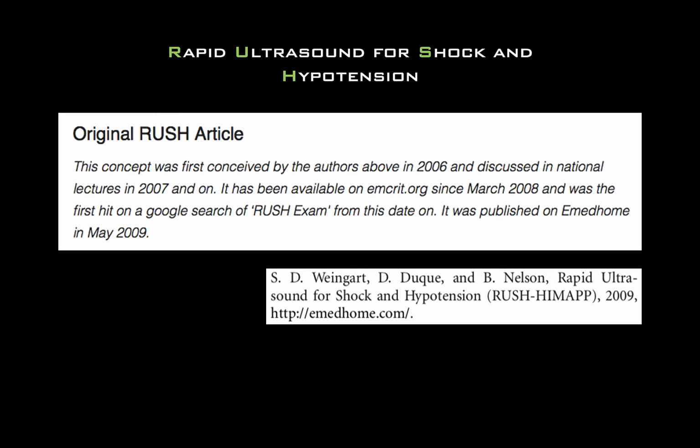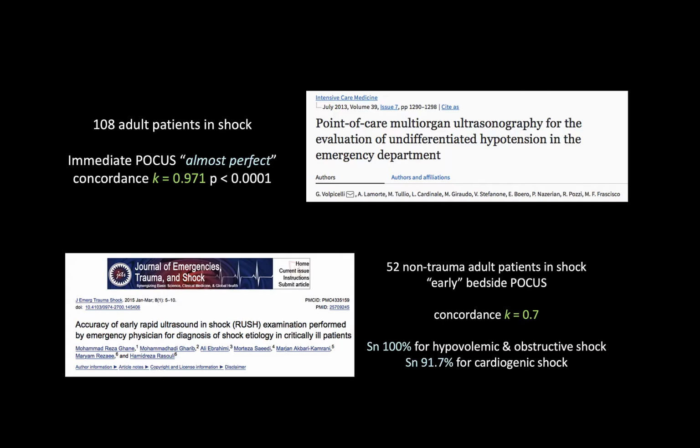So what is the RUSH exam? RUSH stands for Rapid Ultrasound for Shock and Hypotension. While EFAST has been around for a while, a defined protocol for medical patients wasn't introduced until the early 2000s. This is one of the founding papers by Dr. Scott Weingart. Here is a taste of some of the primary literature that demonstrates its usefulness.